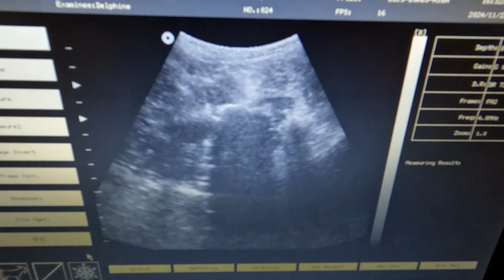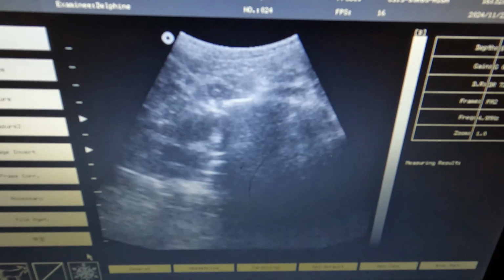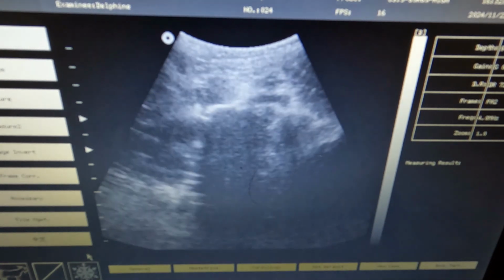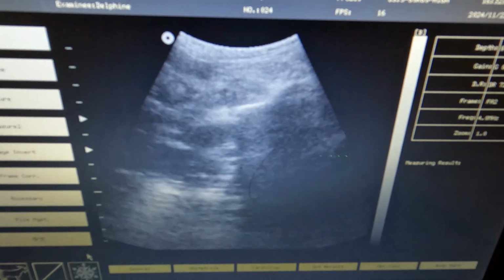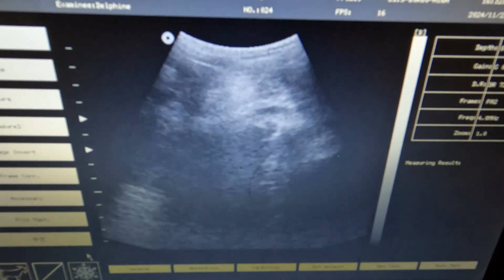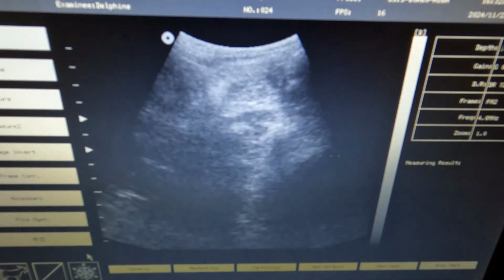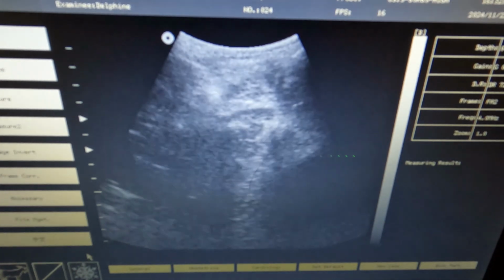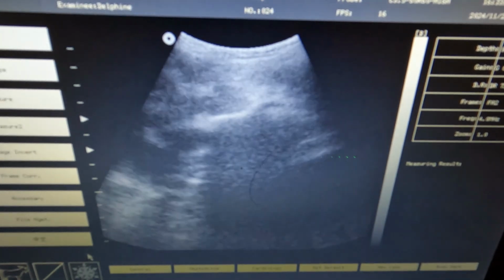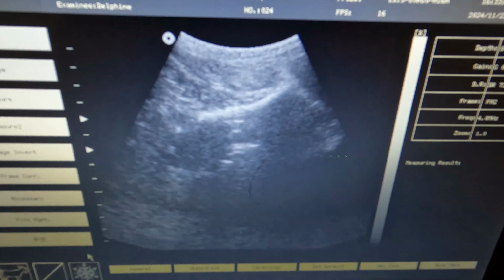And with me not having a whole lot of luck with the machine, because some of them were like clear as day, and some are just super blurry. I don't know what else I can change, because I've messed with the gain, the depth, the frequency, and the focus. My cord's plugged in tight.